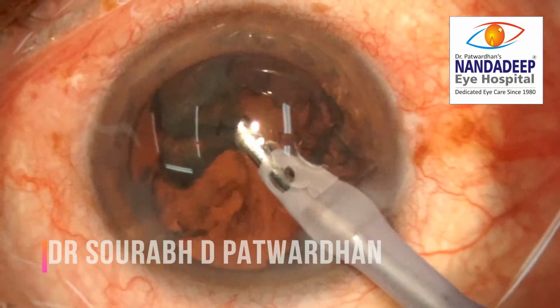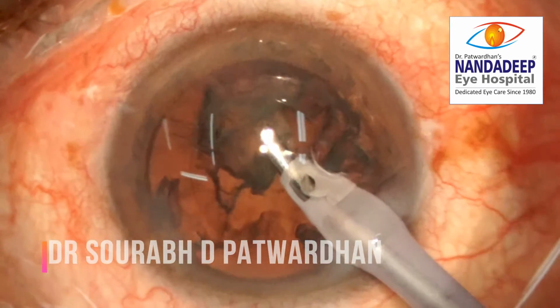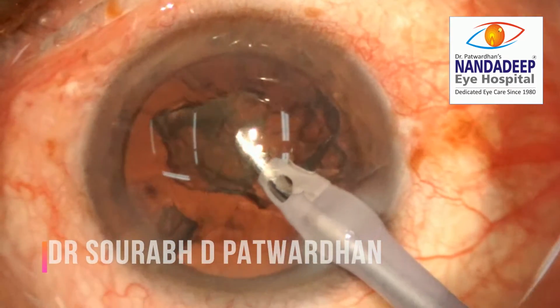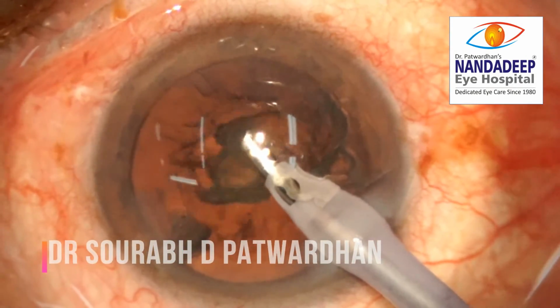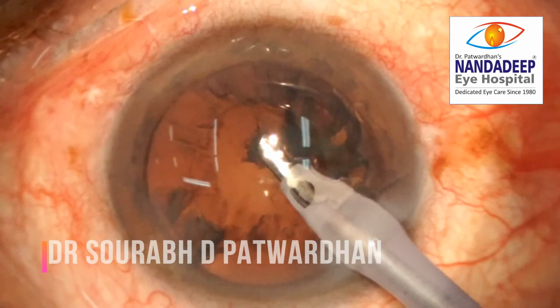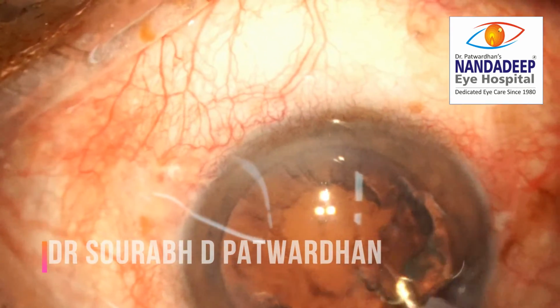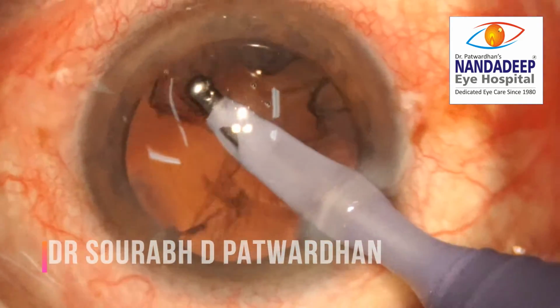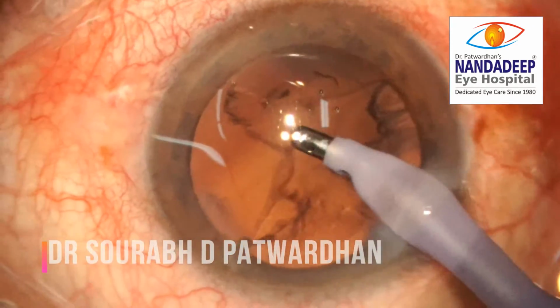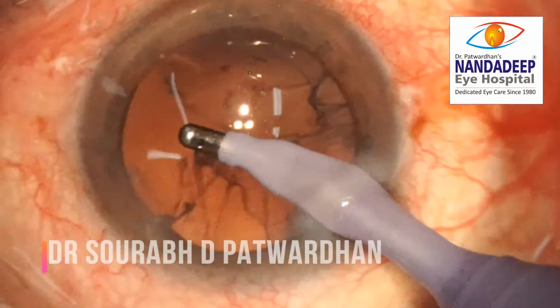So it is important to look into this matter when you start the surgery. If any of the incisions is leaking, you have to tackle it first. Based on the case and the size of the incision, either you can suture the incision and make a new small incision. If it is the main incision which you have inadvertently made large, you may have to shift your position from say temporal to superior and make another incision there after suturing the main incision.